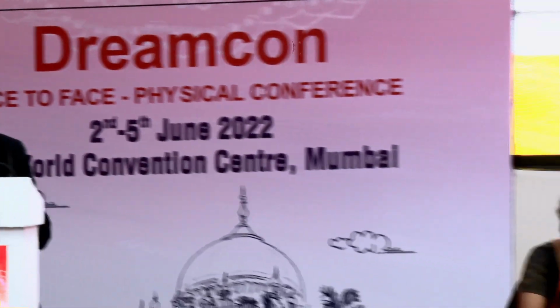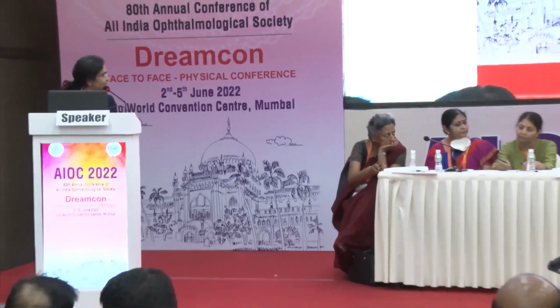Yeah, nice presentation. I just want to know, how did you ensure fixation? Fixation was ensured by using the principal axis and the reference axis, sir. Yeah, but does the patient have a target to fixate? Yes, sir, there's an internal target. Is it a light that he can see? Yes, sir, there's one small cross that the patient can see. How did you reconfirm that the patient is fixating? We are confirming by seeing that the picture gets aligned there. They have seen that the patient is fixating, only then the capture is taken.